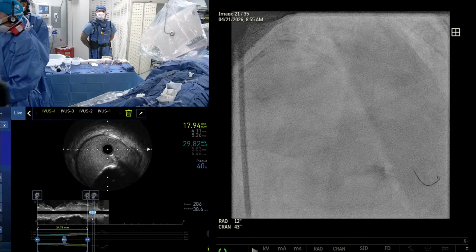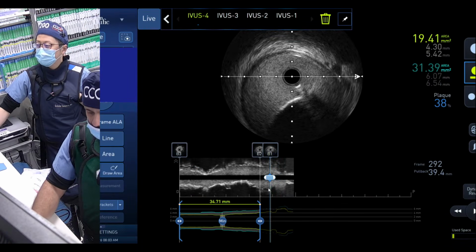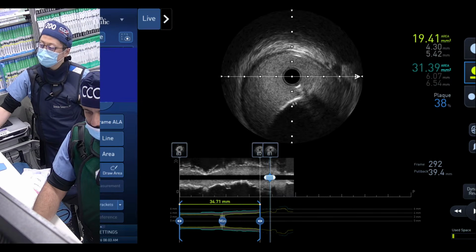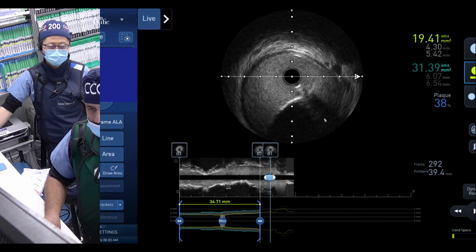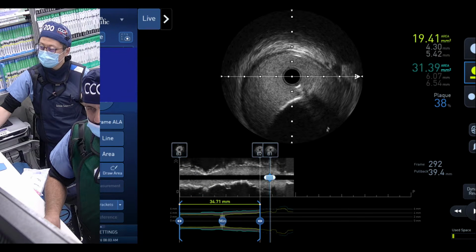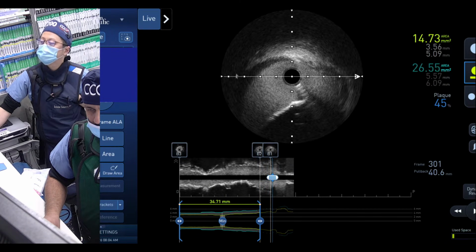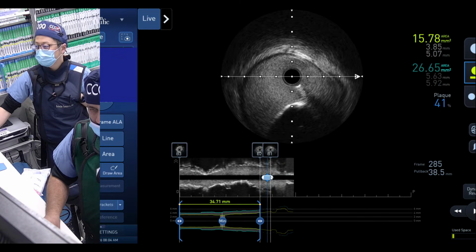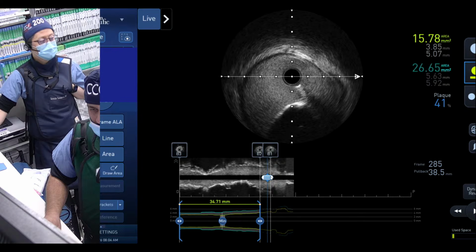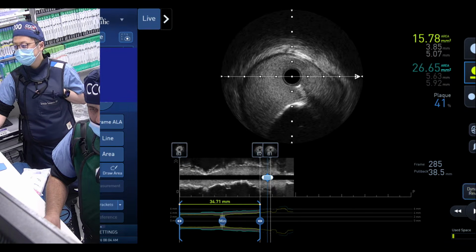Now come to the connection. This is right there. We don't see it. This is again another limitation. IVUS has a limitation because there's an eccentric calcium nodule. We don't see behind this calcified nodule because of the acoustic shadow. So actually, we are not sure what is behind this calcium. I know behind the calcium, but it could be on the other side. No, but the other half is like no dissection based on this IVUS image. But angiographically, it's clear. Big time. Yeah. Angiography shows type B, if not C, because it looks like type B.